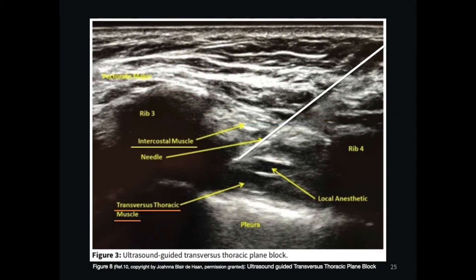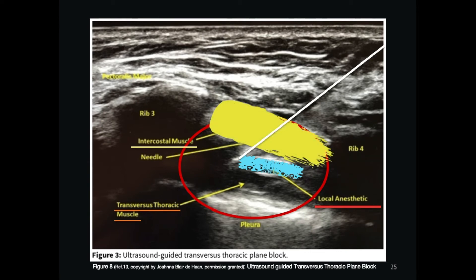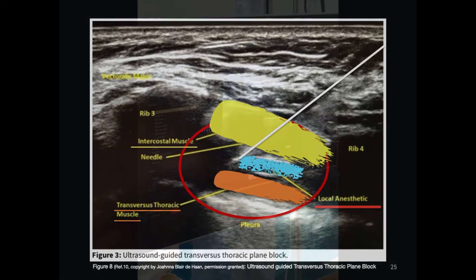In this ultrasound real image, the injection of local anesthesia is shown into the transversus thoracic plane, with the spread of local anesthesia between the internal intercostal muscle and the transversus thoracic muscle.